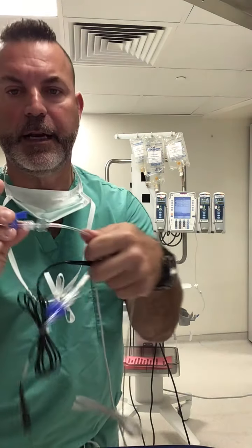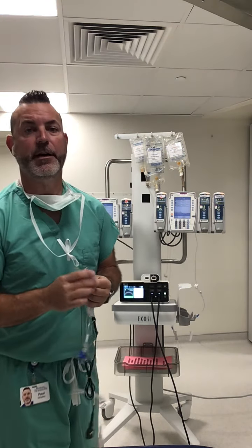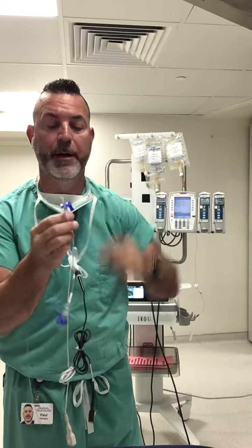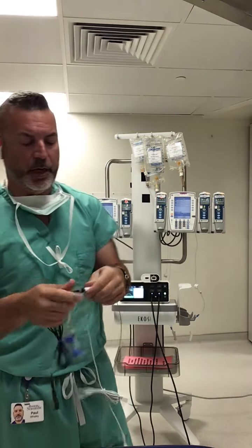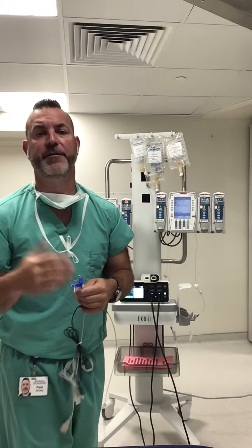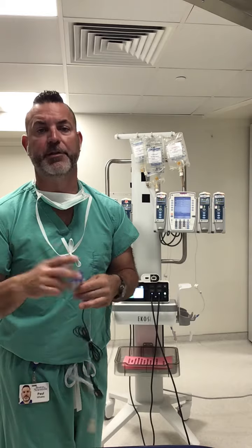Our drug port is red for high-risk medications. Well, guess what? Our thrombolytic medications are high-risk medications. They're going to flow from your bag through your pump, and they're going to hook directly into the back end of my EKOS catheter on the drug port. The drug is also going to flow through this catheter, but they're separate lumens, so there's no cross-contamination between your normal saline coolant and your TPA. We all know that TPA has cost to it, and there's also a concentration, a specific milligrams per hour that the physicians want across the country. So we're not diluting our TPA through our catheter because they're separate channels.